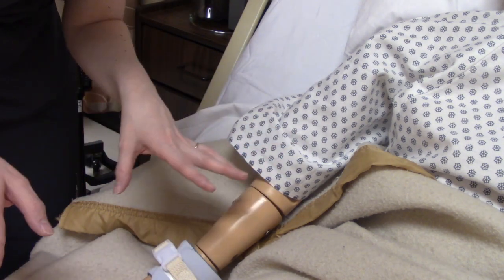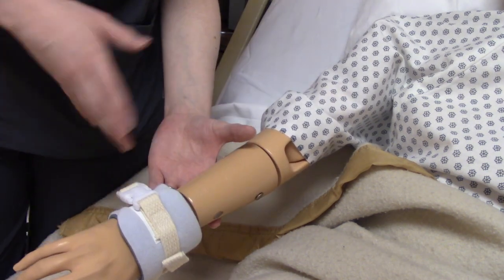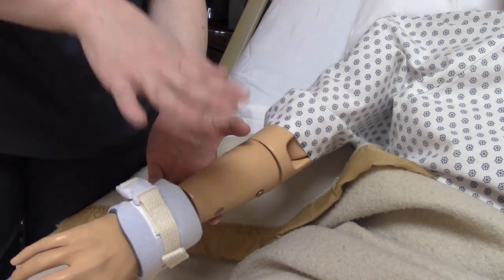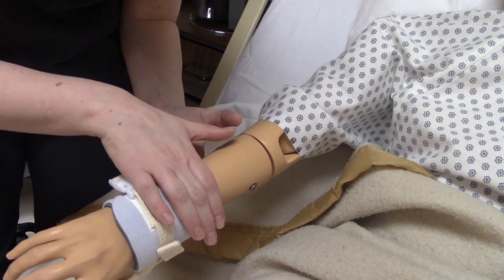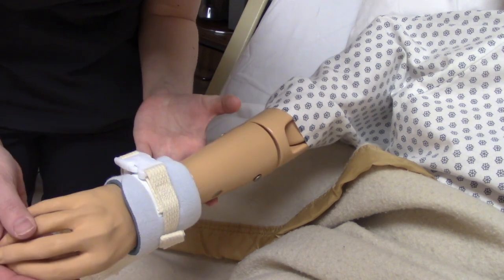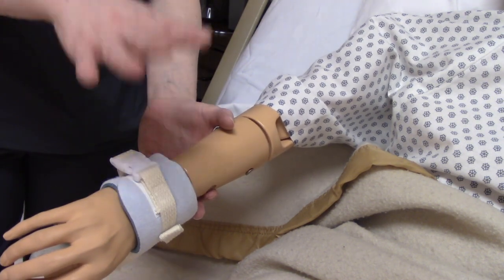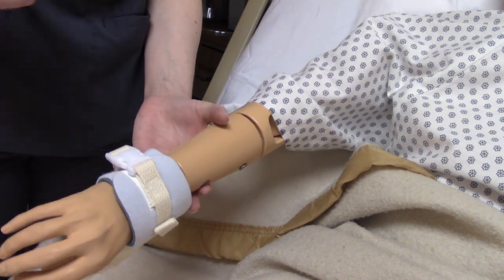We also need to check the area where the restraint is. We need to check for circulation — color changes like pallor or cyanosis, edema, capillary refill — and ask them if it's painful, if it's red, and whether they have any numbness or tingling in the area. We want to make sure this is safe for the patient and isn't causing them harm. So we need to check them every hour and if something's not okay, we need to change it.